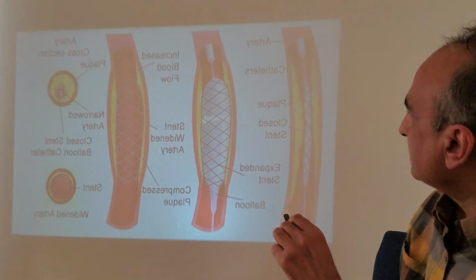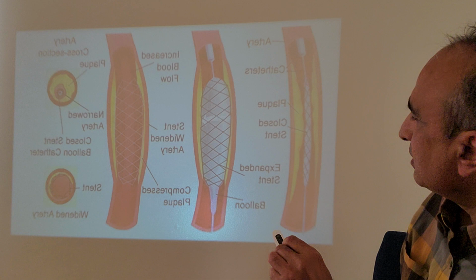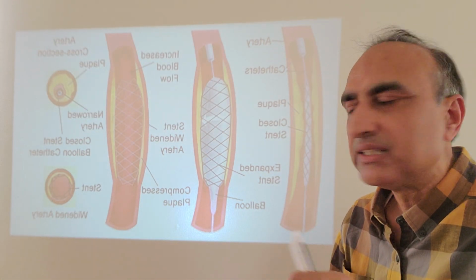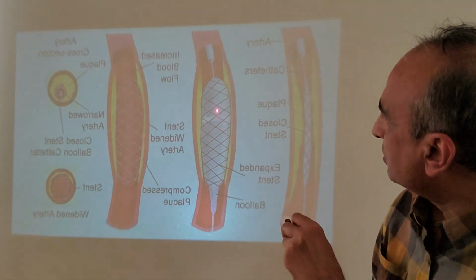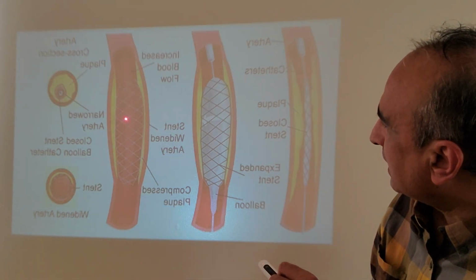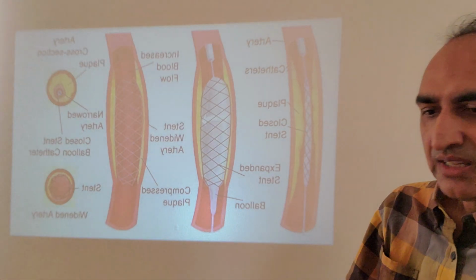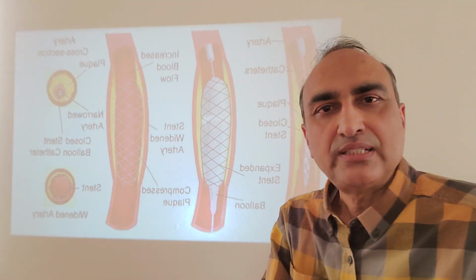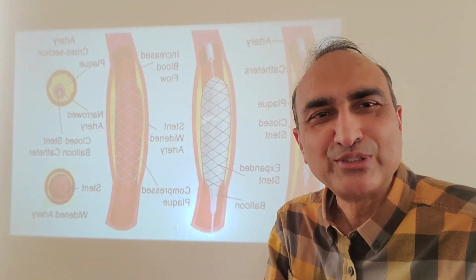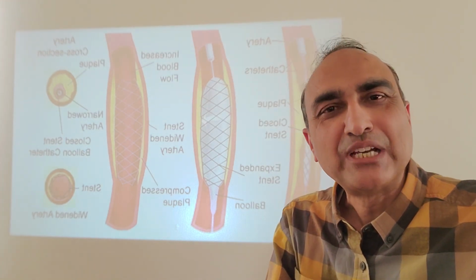And once the stent is expanded, we decrease the pressure which is exerted from the outside, and the balloon comes out, and then the stent, which is here, stays inside the body and keeps the vessel open. But initially, when the stent came in, we got so excited. My God, this is the absolute solution of everything. We're not going to have a problem.